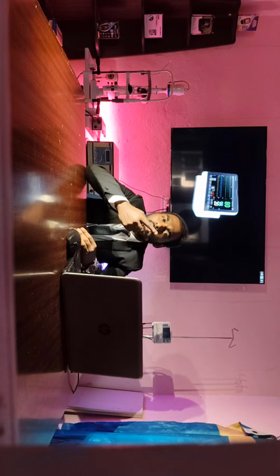Pulse oximeter will have a single port. ECG will have a single port. NIBP will have a single port. But when it comes to temperature, they will have dual ports. Why is this? Just to measure the internal temperature of the human body as well as the external temperature of the human body. Both things are a must.